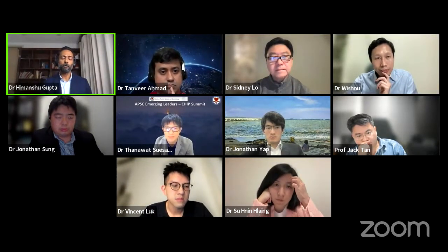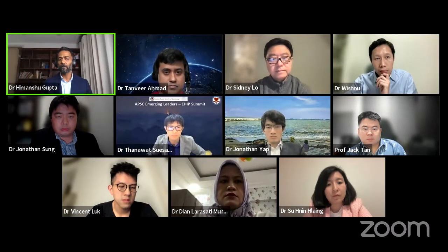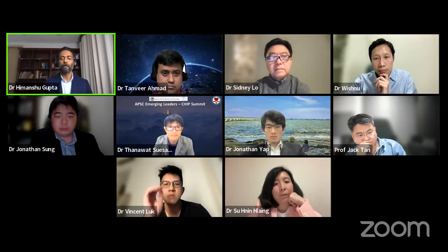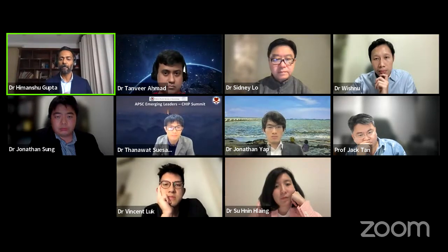Yeah. Thank you, Vishnu. I think both of them were non-STEMI, not ST elevation MI. So honestly, we're not scared to use a rotablator in a non-STEMI unless the troponins are very high or we see a lot of thrombus on the angiogram. But my algorithm of doing rota first is because generally, if you see moderate to severe calcium on an angiogram, especially if it is a diffuse lesion, rotablator is always beneficial. If not in cracking, then in future delivery of devices that you may require. If you don't do a rotablator, you may crack with a balloon, but then sometimes your stent delivery is troublesome, and sometimes your bifurcation treatment is troublesome. Once you smoothen the vessel out with a rotablator, your procedure becomes very predictable later on.